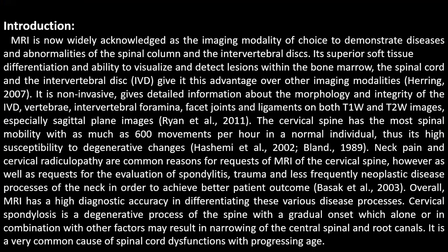It is non-invasive and gets detailed information about the morphology and integrity of the intervertebral disc, vertebral bodies, intervertebral foramen, facet joints, and ligaments on both T1 and T2 weighted images. Then, neck pain and cervical radiculopathy are the most common reasons for the request of an MRI of the cervical spine. However, overall the MRI has high diagnostic accuracy in differentiating these various disease processes.